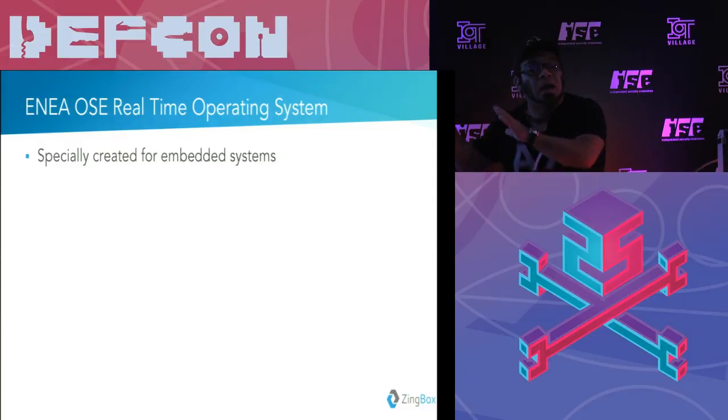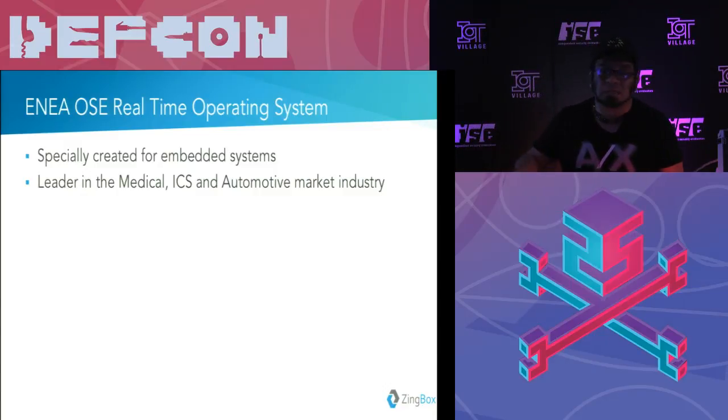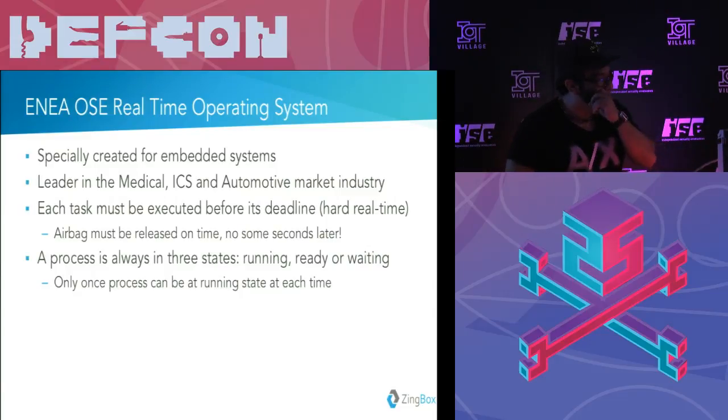That's the reason for these architectures: airbags, ABS in cars, or other specific critical systems need to react right away. That's the purpose of real-time operating systems. This specific company, ENEA, is the creator of this real-time system. It's a Linux-based ARM system, and it is all around. It is in medical, in industry, in automotive, in industrial control systems also. And as I said, it must meet a deadline, otherwise it's a problem.